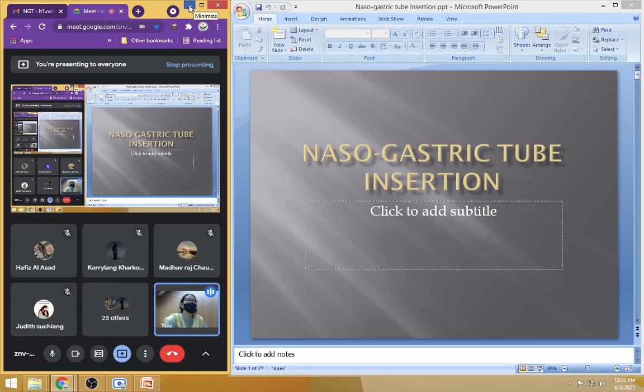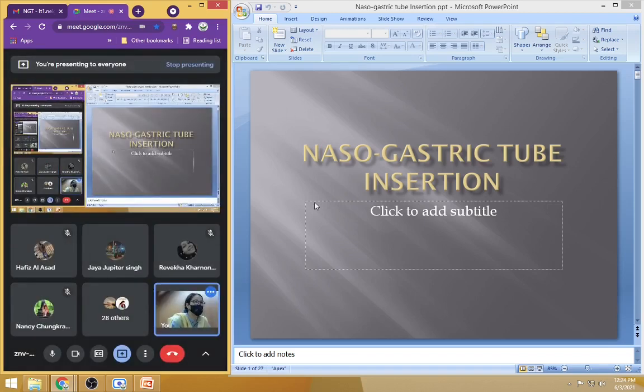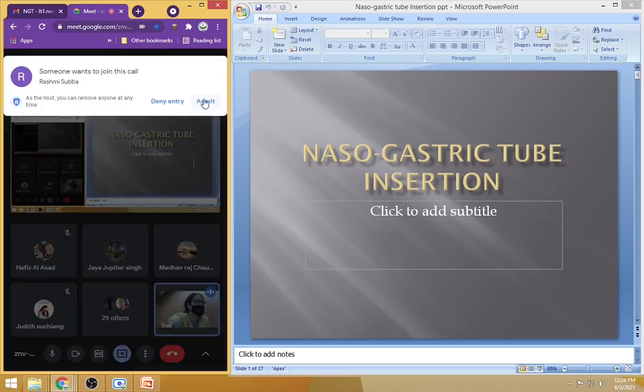Do you still remember the nasogastric tube insertion which we discussed in the clinical? What is a nasogastric tube? Why do we use a nasogastric tube? Ma'am, for providing food. And what else? Have you ever seen a patient with an NG tube? Patient is unable to take oxygen properly. Nasogastric tube is not for oxygen. Oxygenation is by nasal cannula, no? Ma'am, like Ryle's tube. Nasogastric tube is Ryle's tube.